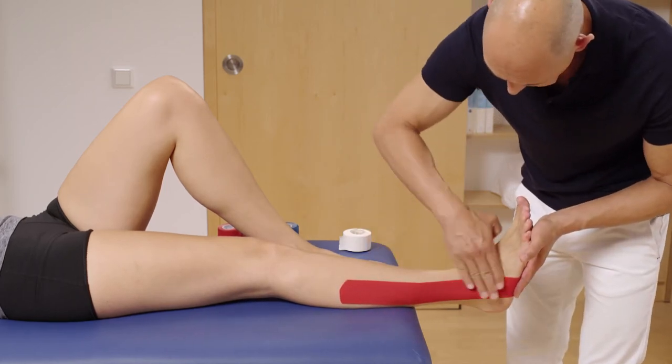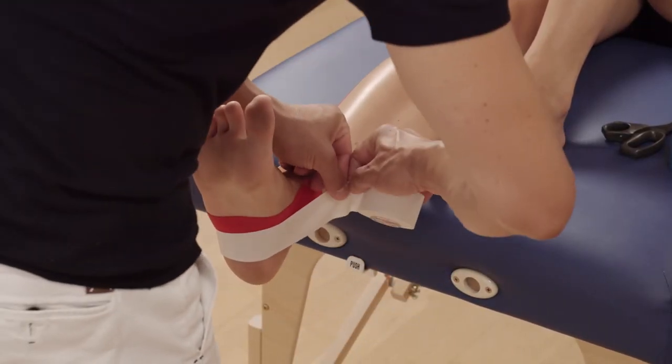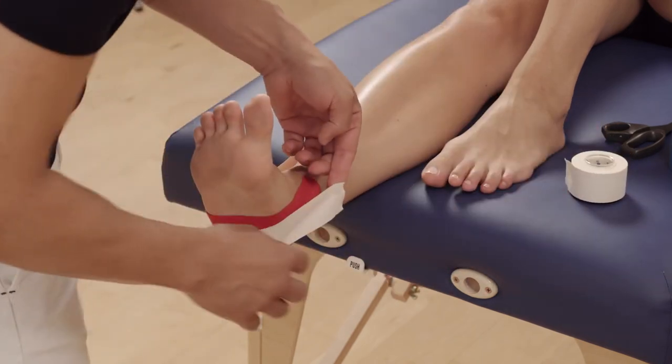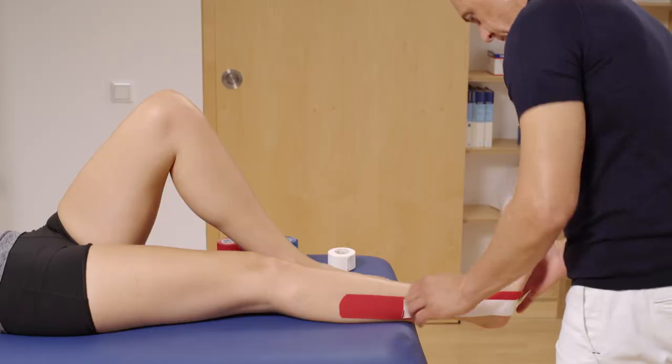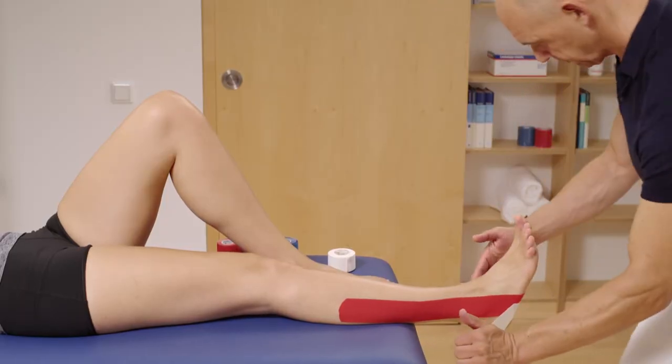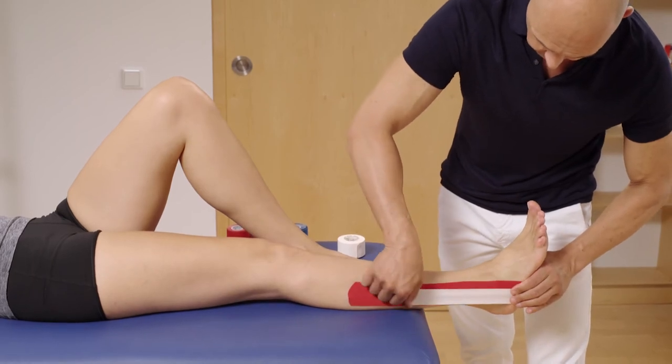Now lay LoicaTape Classic around the sole of the foot starting on the lateral side of the leg. Tear the tape off the roll on the medial side at the height of the already applied LoicaTape K strip. Pull over the tape on the lateral side, stick on the end of the strip, then rub the middle part of the tape.